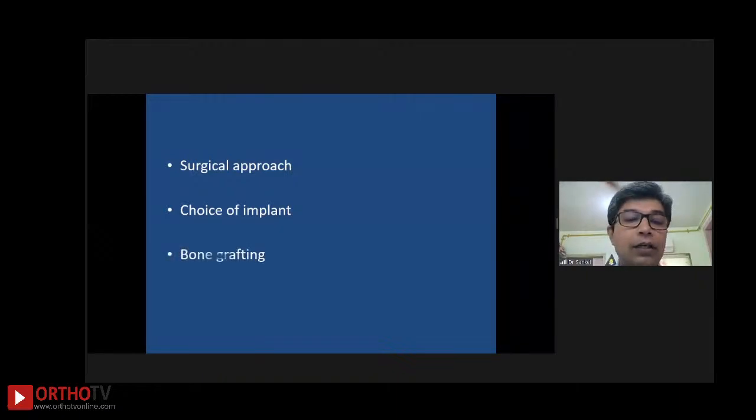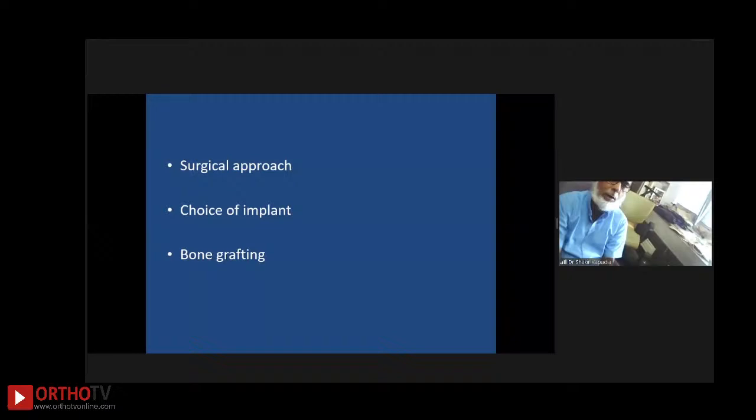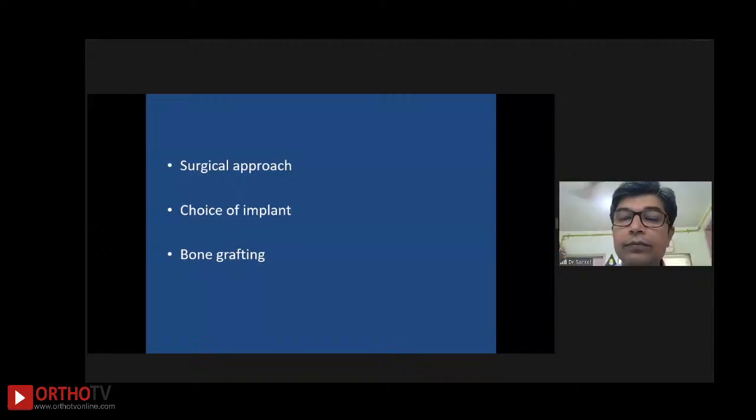And lastly, bone grafting should be in consideration. In this case we have the native femoral head, so if we feel that bone graft is required, we can always get some bone from the femoral head. You will definitely need bone graft. Because I have a protrusio there, bone grafting should possibly be mandatory. So, Sanket bhai, no CT scan.